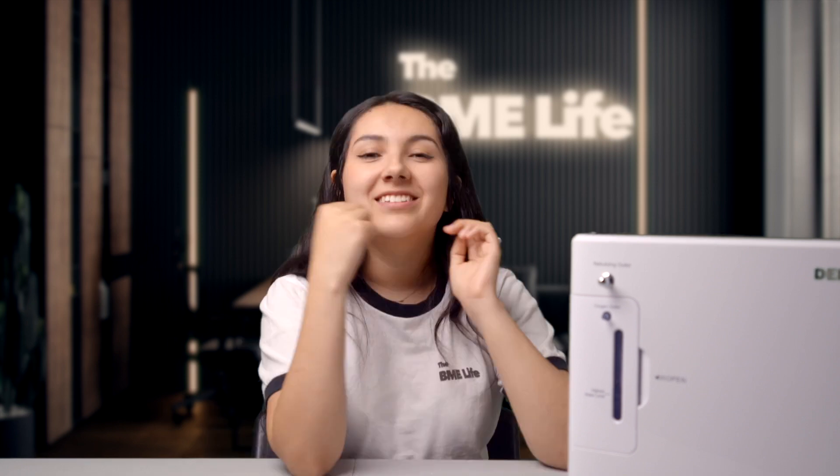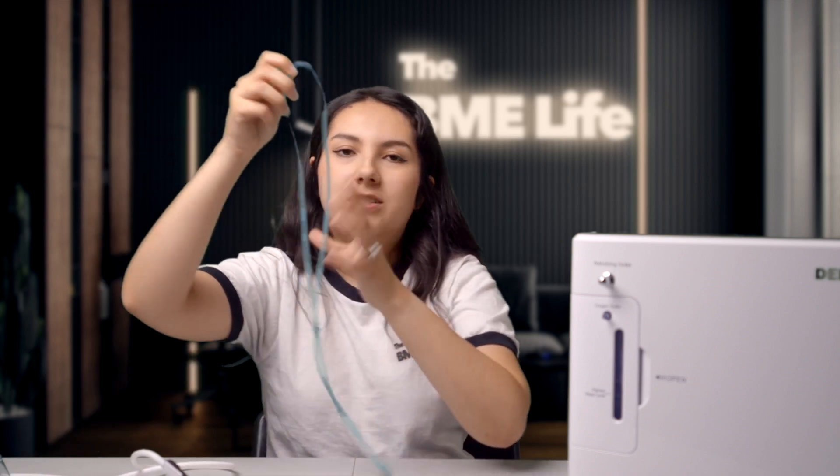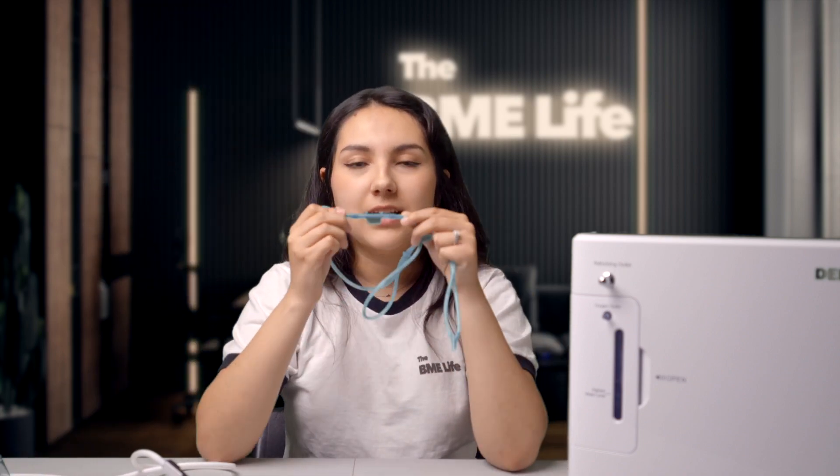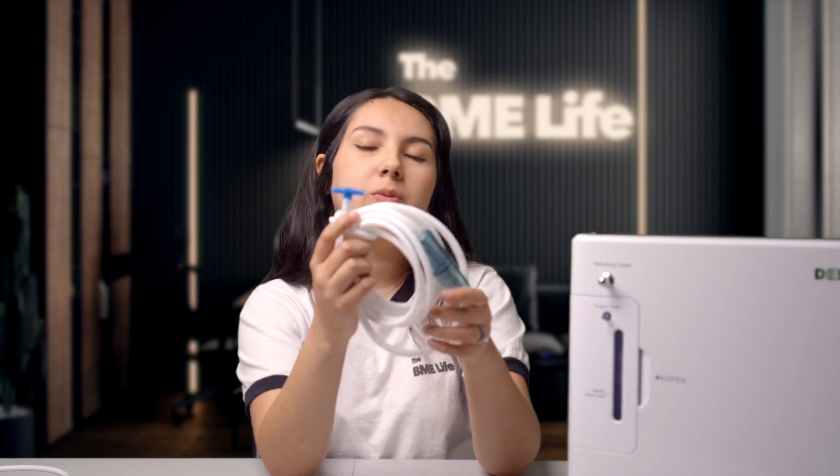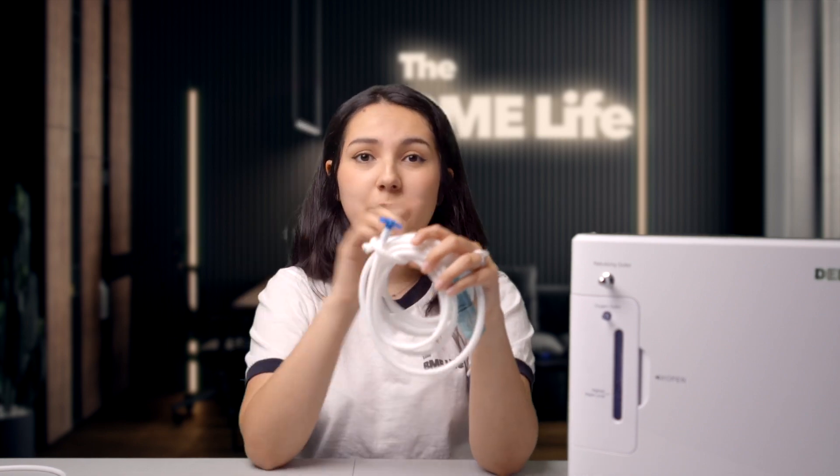Please don't inhale high purity oxygen without consulting with your doctor first. The device comes with the main oxygen concentrator, which has a touch screen at the top with all the controls. It also comes with tubing in different configurations: a headset-looking one, a typical nasal cannula, a small mask for children, a bigger mask for adults, and tubing with a T-connector so that two people can use it at the same time.